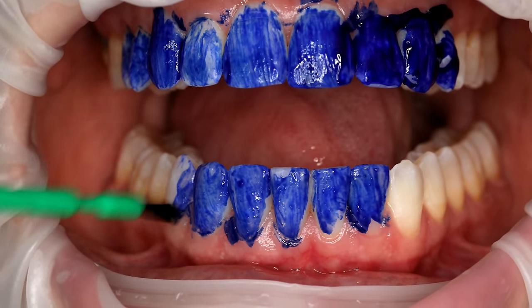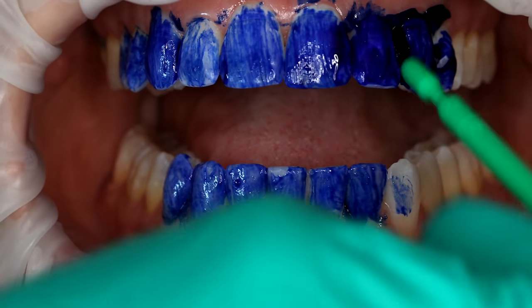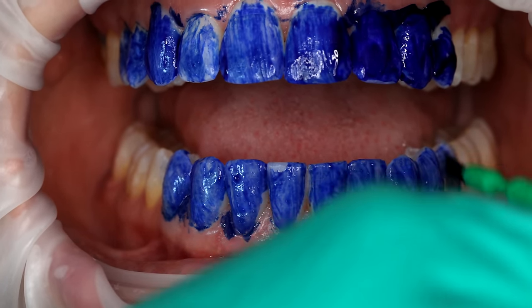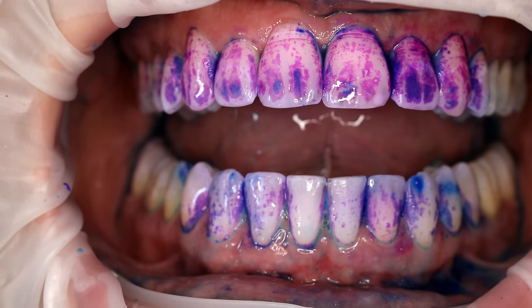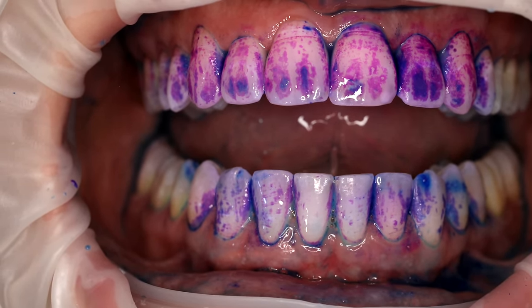The amount and type of buildup on the teeth will impact the process. This modern technique is going to be most effective on patients who, one, come routinely for hygiene visits, and two, have good to excellent home care practices. These two factors will greatly reduce the amount of plaque and calculus that builds up on the teeth.